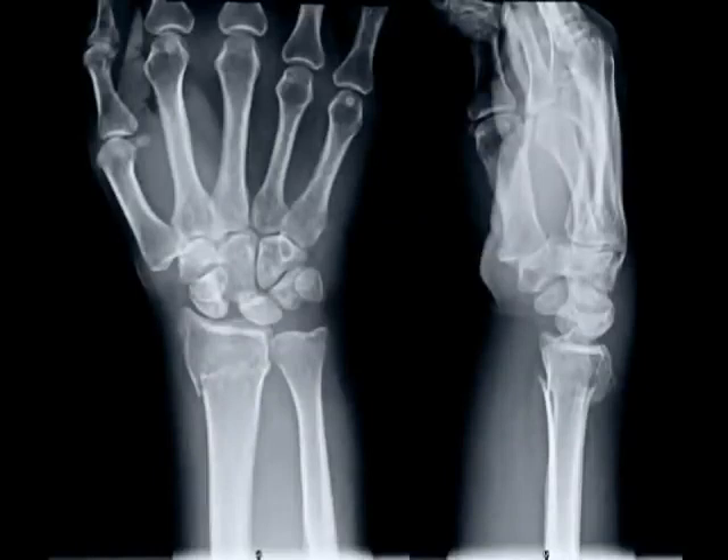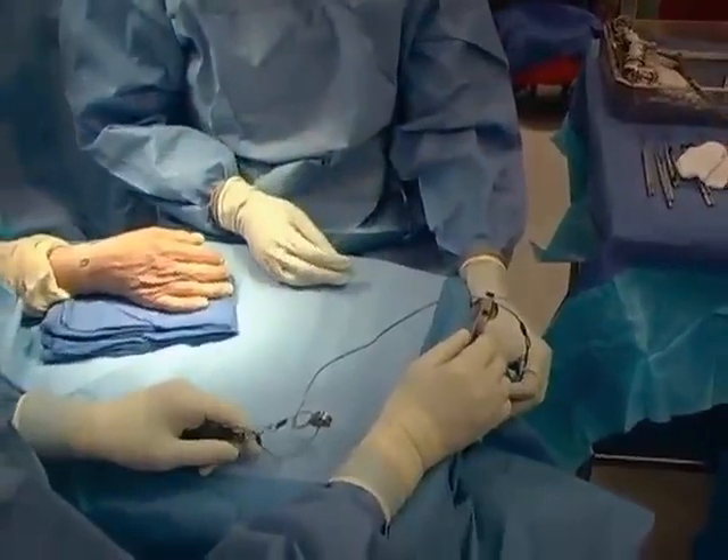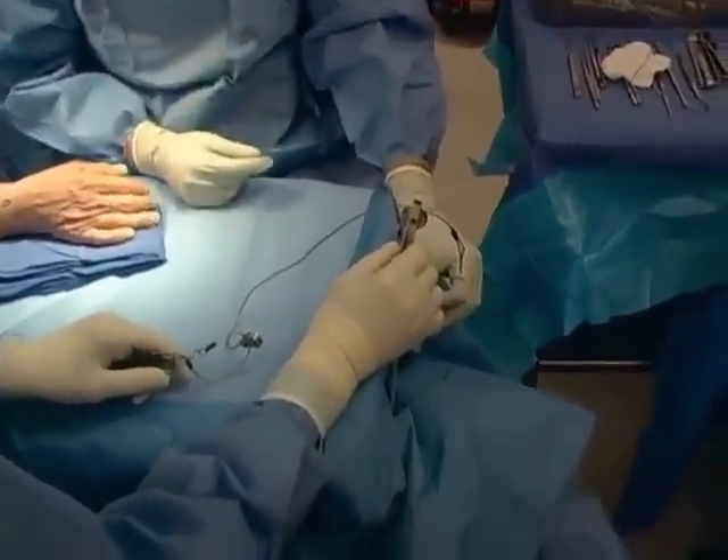This is the technique of percutaneous pin fixation for treatment of distal radius fractures. This patient had a fracture of the metaphysis with dorsal tilt of the distal radial articular surface and scapholunate dissociation. The plan was to address the distal radius fracture with percutaneous pin fixation. The technique is done optimally with the patient in longitudinal traction to distract the fracture fragments.